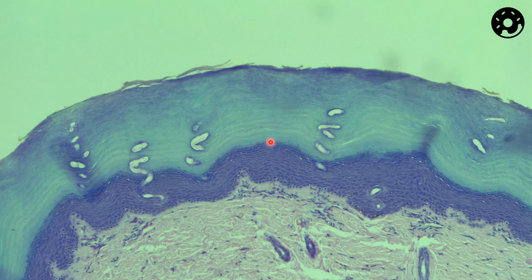Now, if you see this darker blue, darker purple, and how it's different from right here in color, okay, go ahead and get real close to your screen. You're like, I don't see it. I'm going to turn all of you into interior design people, okay? So this darker purple here compared to this lighter bluish purple here. This dark one here is actually Stratum Granulosum, okay? Stratum Granulosum. So all the way here we see Stratum Granulosum.